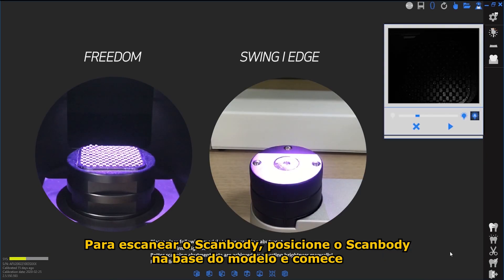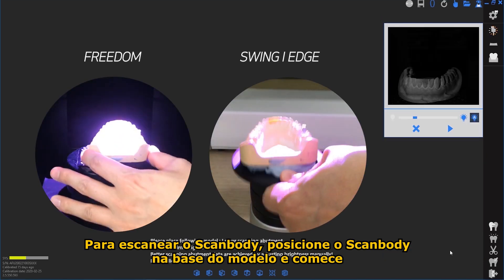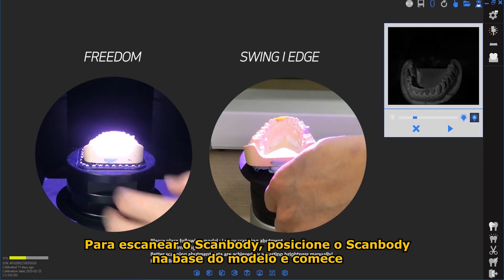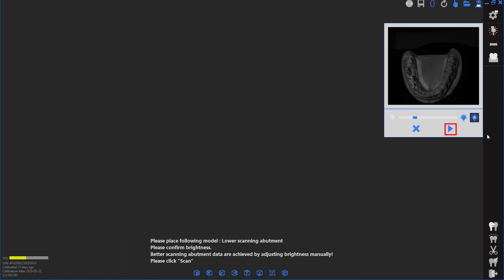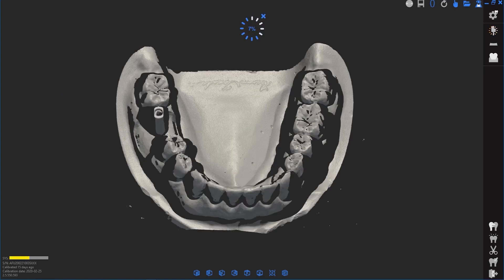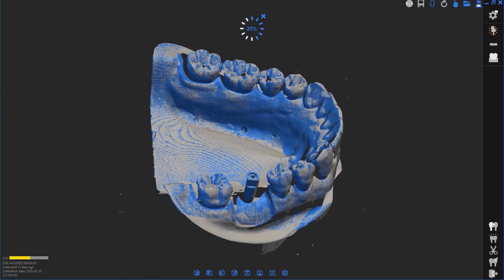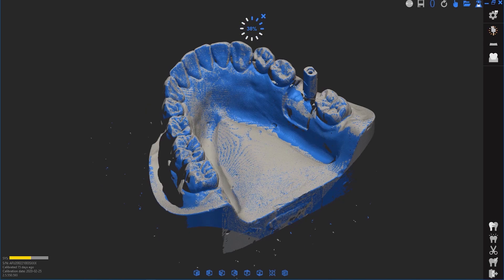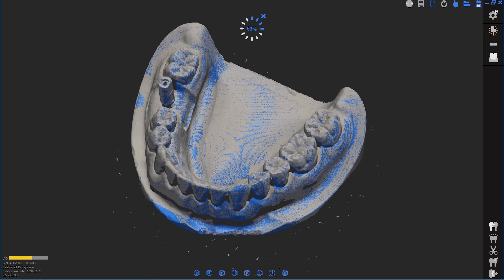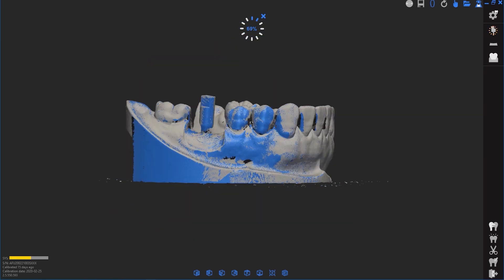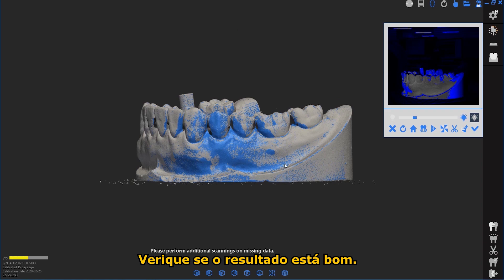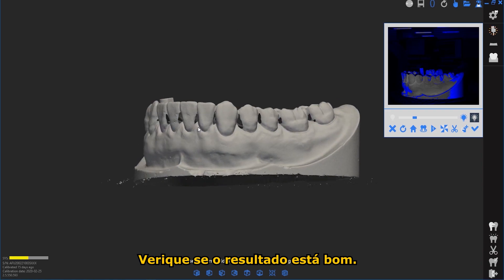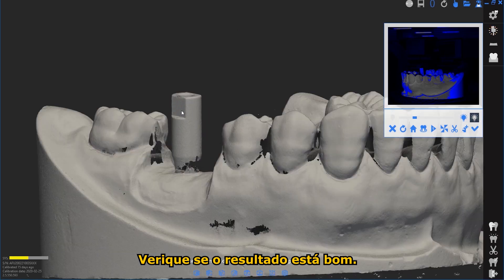To scan a scanbody, place the scanbody onto the base model and scan. Verify that the scanbody has been scanned accurately.